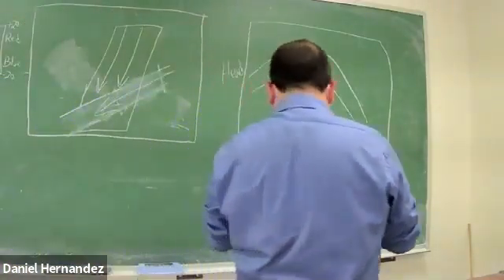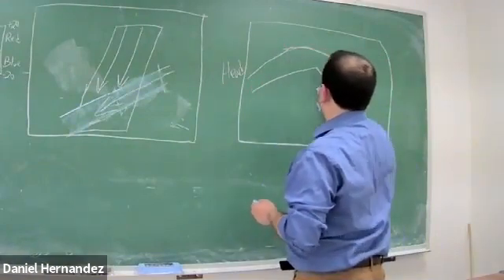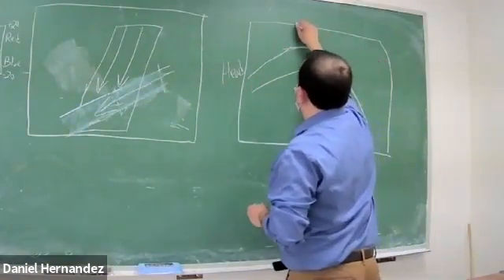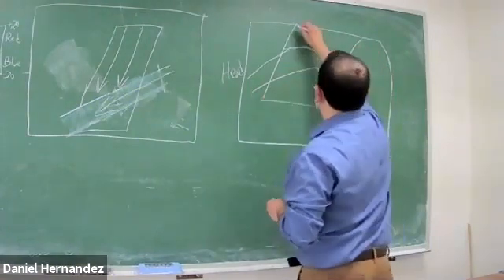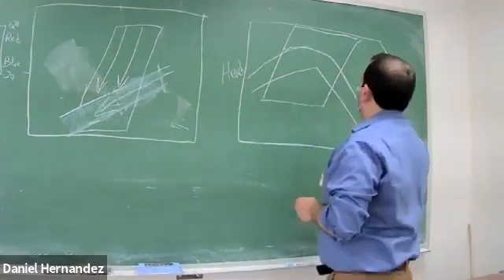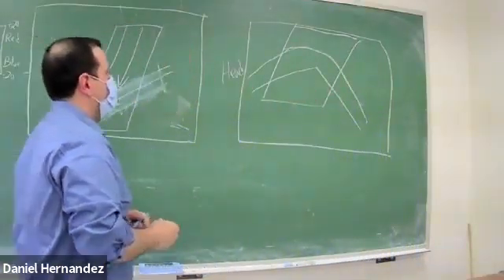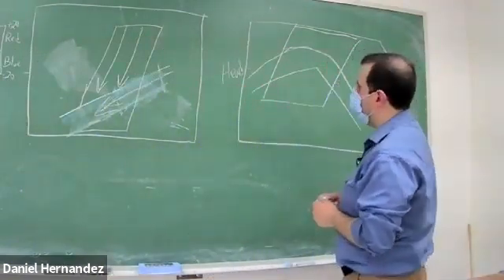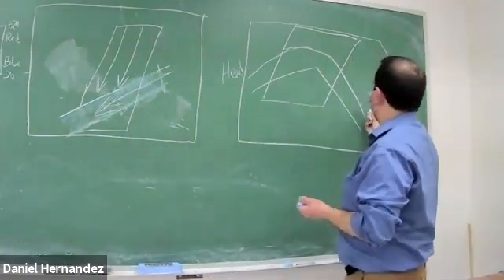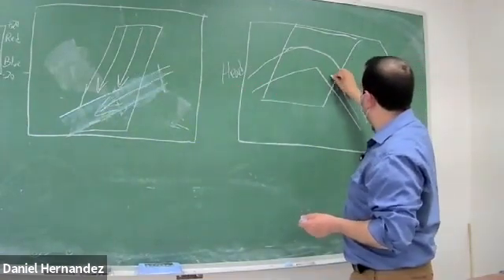So if I had a vessel that was a little tortuous and curved, you have to look at the entire thing at different segments as to whether the blood flow is coming towards your beam or away from your beam. For this example, we have our blood flow still coming up the vessel.